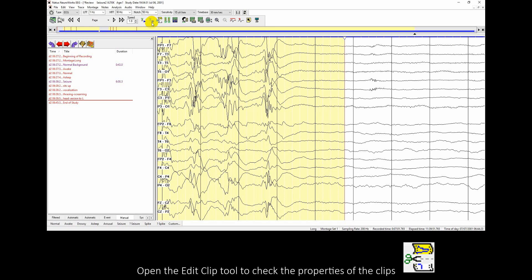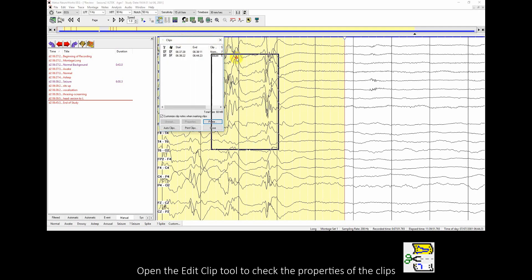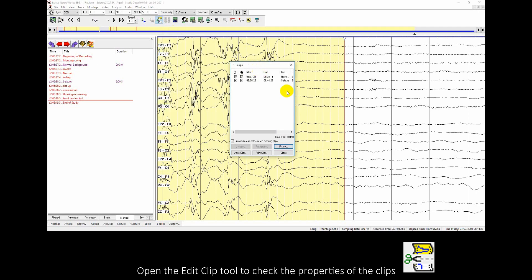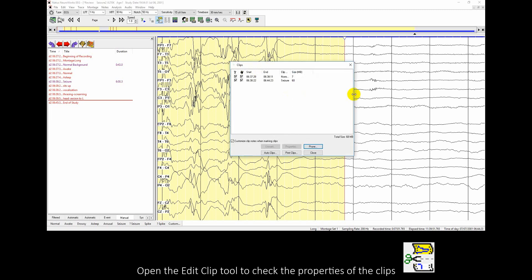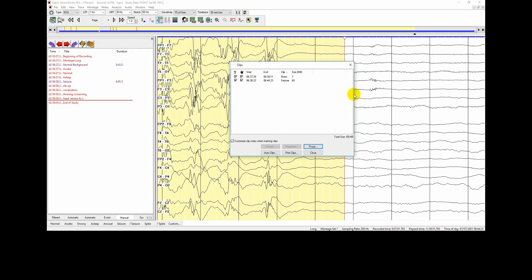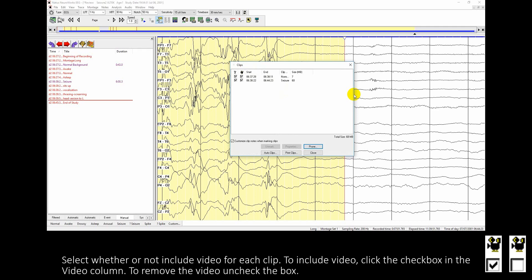Open the Edit Clip tool to check the properties of the clips. Select whether or not to include video for each clip. To include video, click the check box in the video column. To remove the video, uncheck the box.